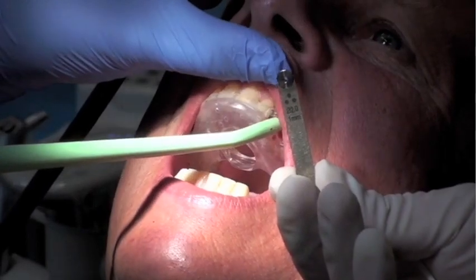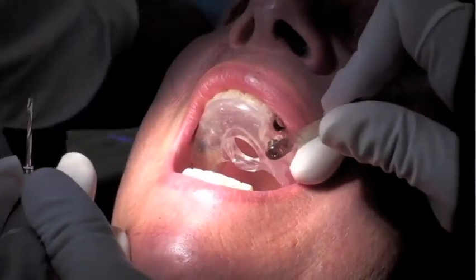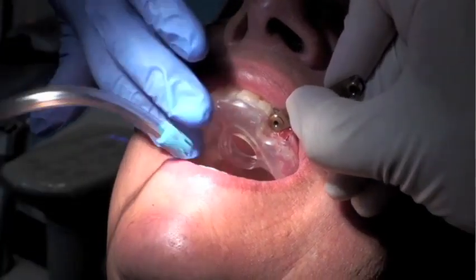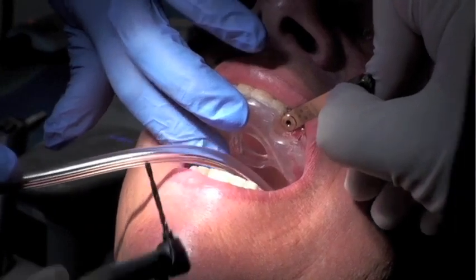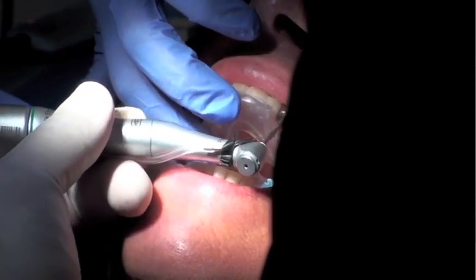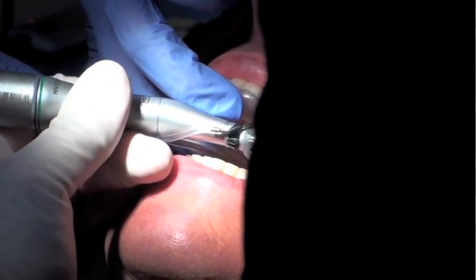We're going to start with a 2.0 twist drill with a 1 millimeter key height. All of these keys are selected using the CCAT and Facilitate surgical guide recipe, which is provided with each and every case. So our initial osteotomy is essentially a 2.0 twist drill. Heavy irrigation.